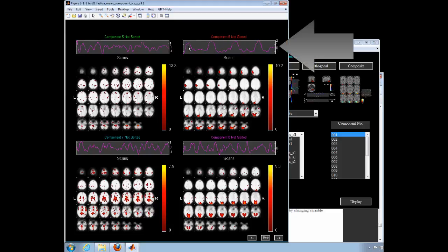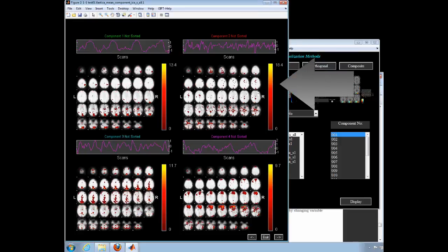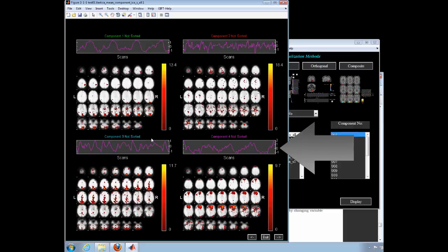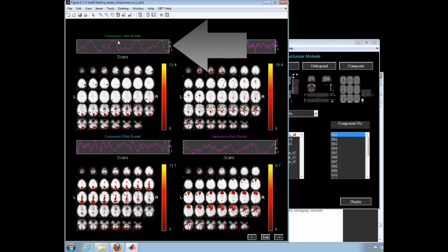The time patterns we are looking for should have a fairly smooth pattern like we see in components one and six. Component four also appears to be a predictable pattern, but it may be only transiently related to the task.